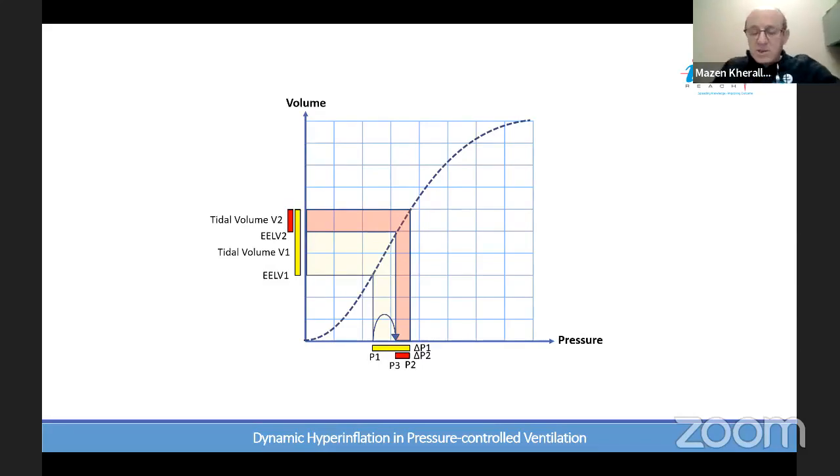Yeah, that question is difficult because he's right. Patients with emphysema have high compliance. When they develop Auto-PEEP, meaning that the air goes in and does not completely come out, the principles are the same. I need to provide enough time for those patients to exhale the air.